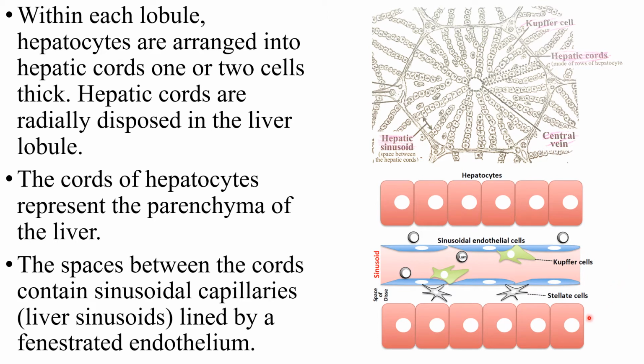And in between two such hepatic cords, there are some spaces, and this space will have the sinusoidal capillaries, and this space is called the liver sinusoids.